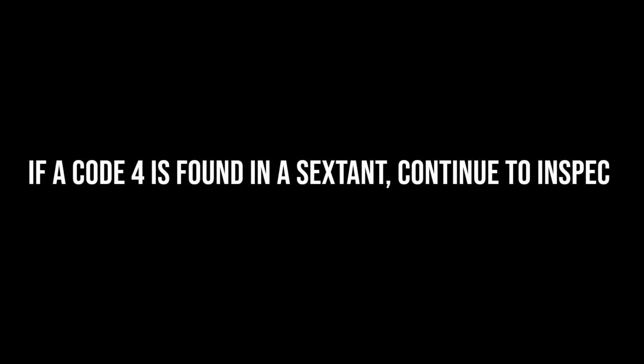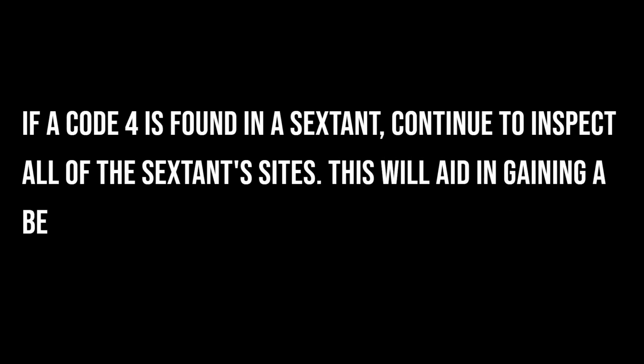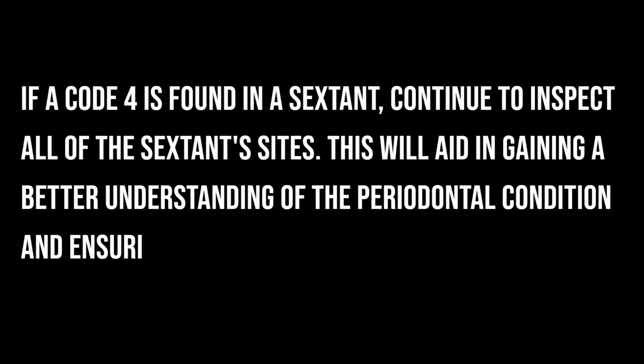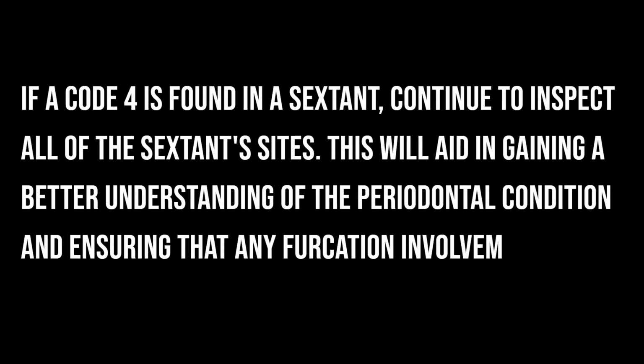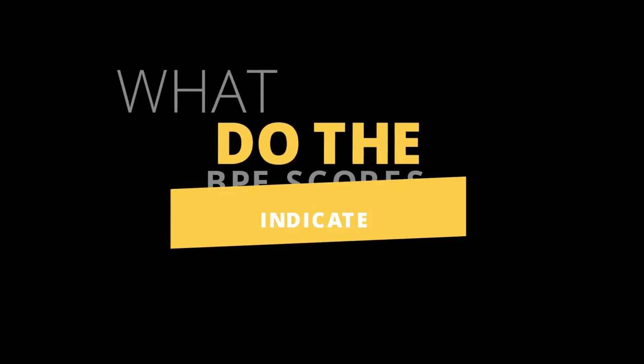If a code 4 is found in a sextant, continue to inspect all of the sextant sites. This will aid in gaining a better understanding of the periodontal condition and ensuring that any furcation involvements are not overlooked. What do the scoring codes indicate?